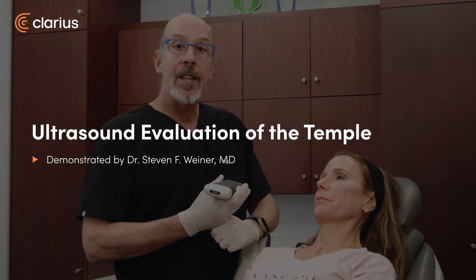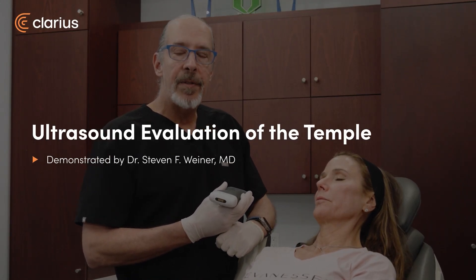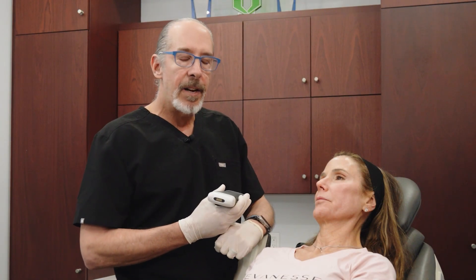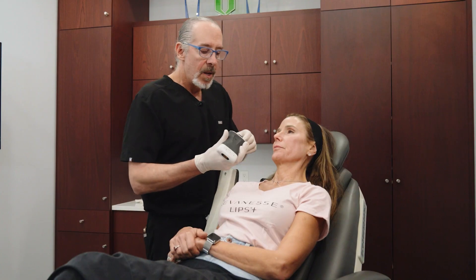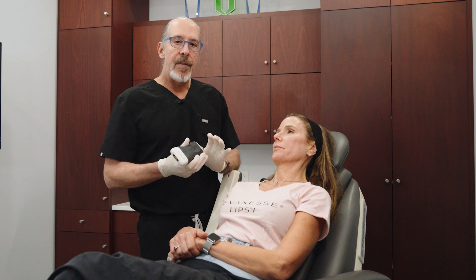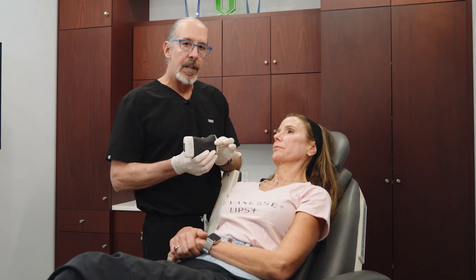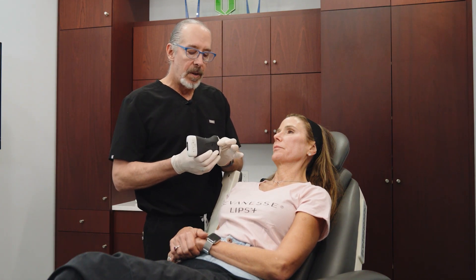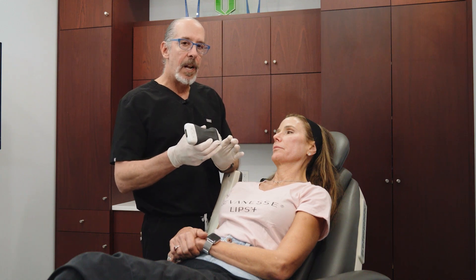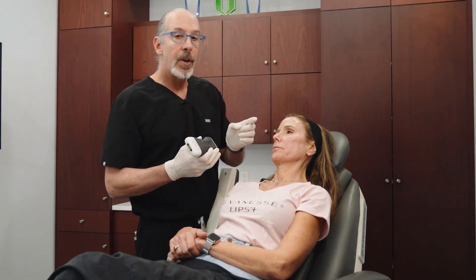The next area of evaluation is the temple. It's my favorite area because it's a very complex anatomy with several different layers. The way I like to evaluate the temple is not quite horizontal and not quite vertical — it's in an oblique fashion, paralleling the orbital rim.